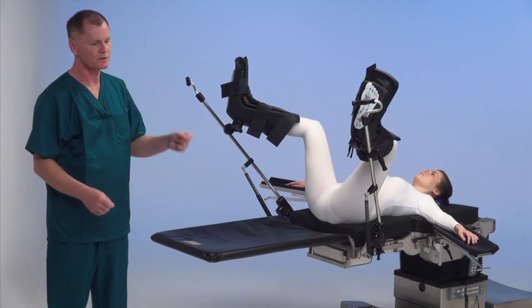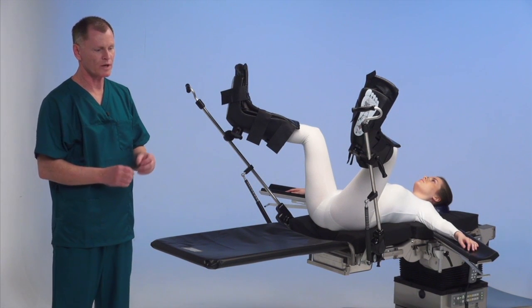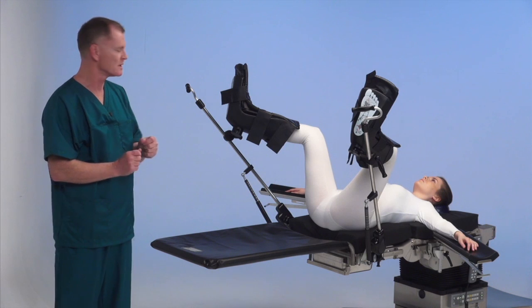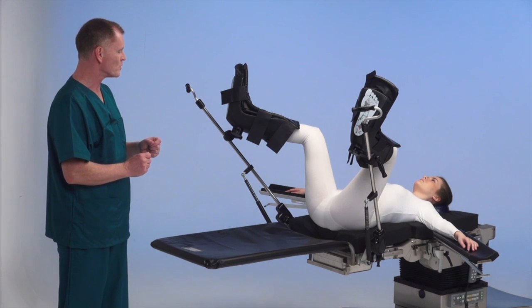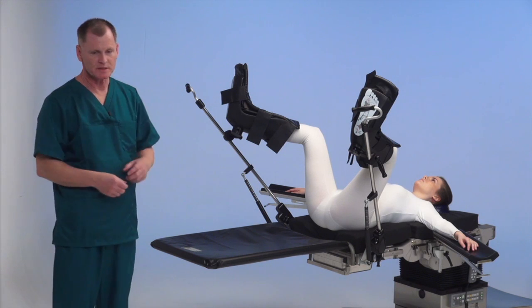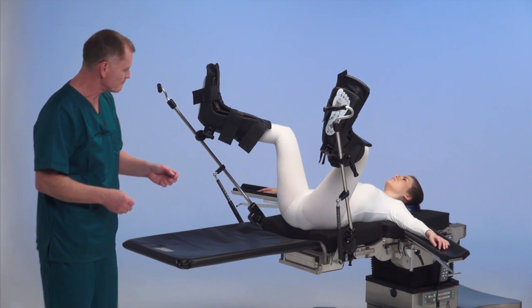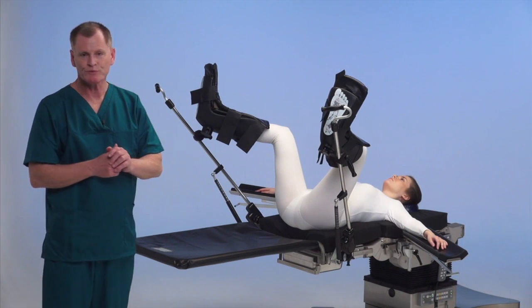The other question you need to know: will the surgeon require a foot switch? A lot of times in urology cases they want to control the table themselves for TURPs, prostatectomies, and TURBs — which is transurethral resection of the bladder. Make sure you know if he needs a foot switch ahead of time.